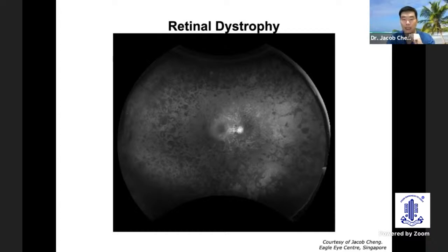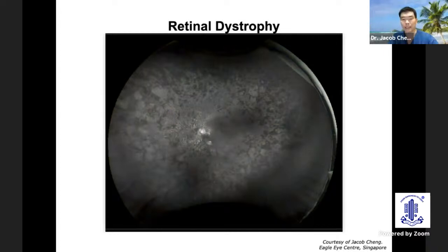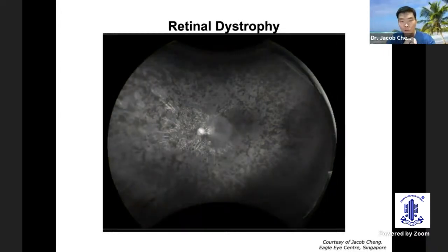in this patient's right eye. This patient, similarly, on the opposite eye, on the left eye, has a very stormy, very ugly looking kind of retina because there's lots of pathology in the periphery, but you can see that the choroidal retinal atrophy is mainly limited to the nasal, superior, inferior, sparing the posterior pole, as compared to this next patient.